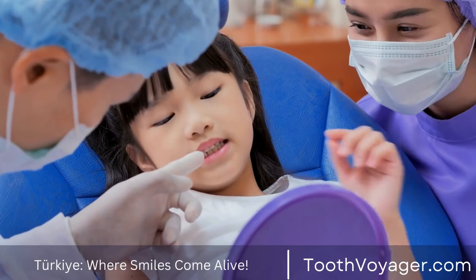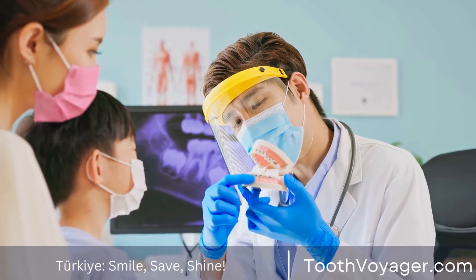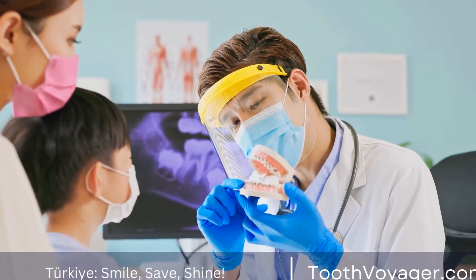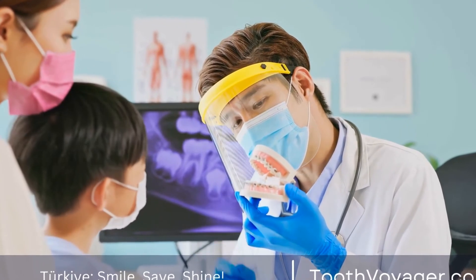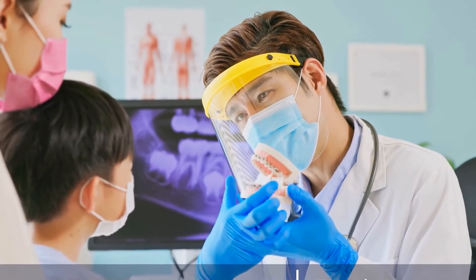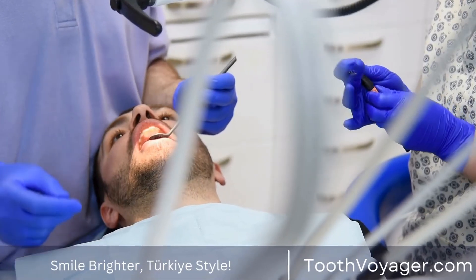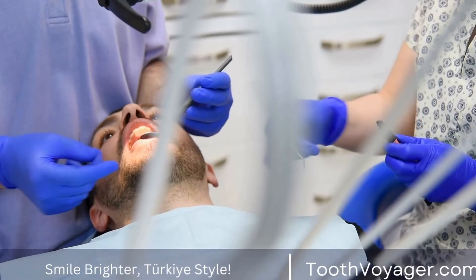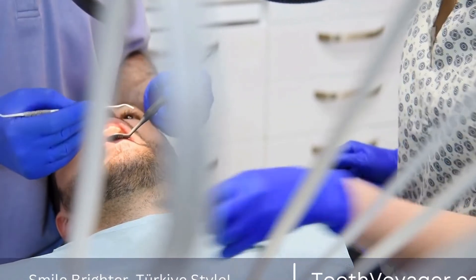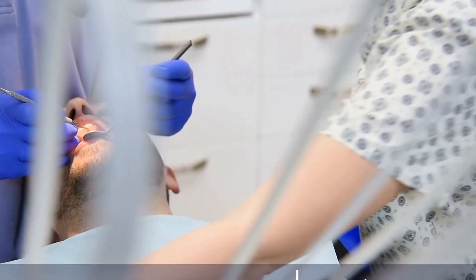Step 3: Cleaning the Tooth. Once the anesthesia has taken effect, your dentist will start by drilling a small hole in the tooth to access the infected pulp inside. The infected pulp, which is made up of nerves, blood vessels, and connective tissue, will be removed using special dental instruments.